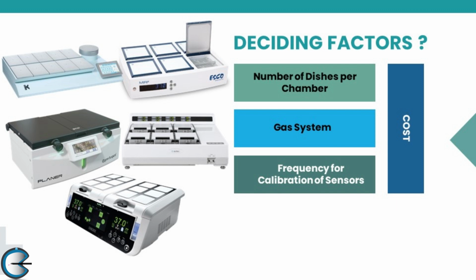the kind of gas source, because it will completely depend on the availability of proper gas mix cylinders wherever you are located, and the frequency of calibration of sensors if you happen to choose an incubator with a gas mixer. Another factor which plays a very critical role in the choice of an incubator is what model of existing incubator you have, how many gas lines you have in your IVF lab, and what is the ease of adding one more gas line in your IVF lab. So all of these factors combined help you choose the next incubator that you want to purchase.